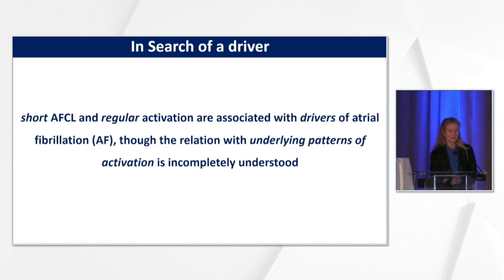But for this presentation, because I noticed that Dr. Berenveld was presenting before me, and they are presenting on AF, on the rotors of AF, I thought, let's try to find in my population if I can find a driver using criteria which are used in the cath lab. So simply the extracellular potentials, and they say that if you have a short atrial fibrillation cycle length and a regular activation, it's associated with drivers of atrial fibrillation. But if you take a critical look at the literature in the clinical studies, the relation between these parameters and the underlying patterns of activation is incompletely understood.